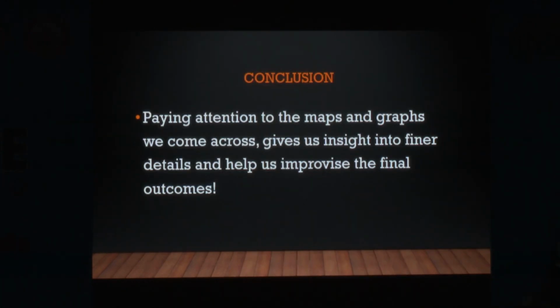So to conclude, paying attention to the maps and graphs we come across gives us insight into finer details and helps us improve the final outcomes in cases of biometry.